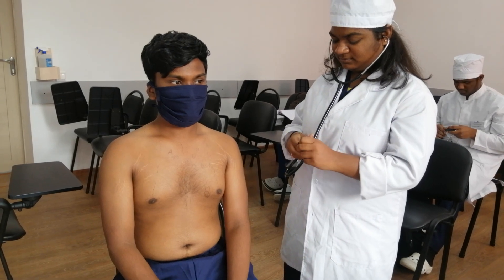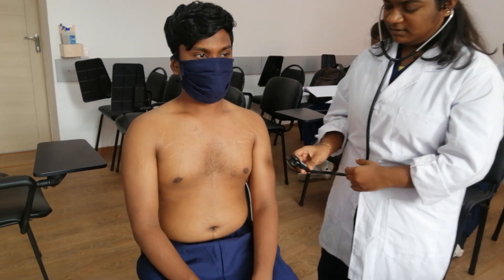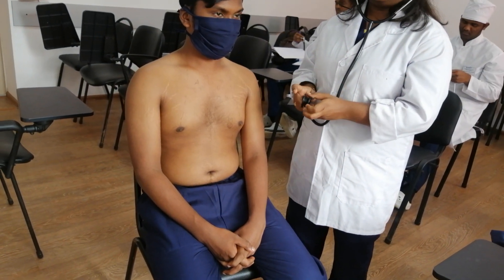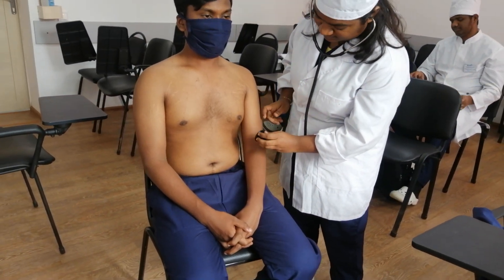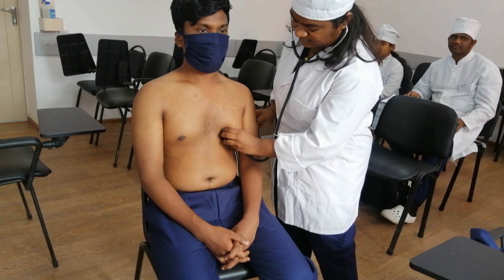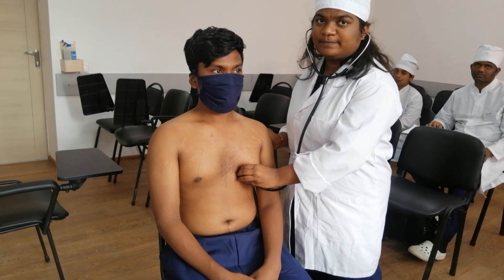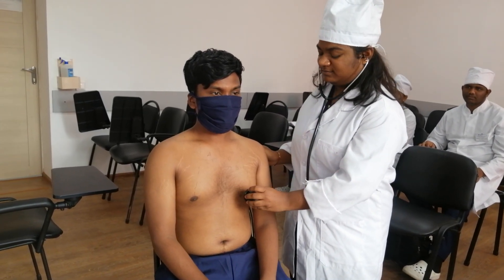Check the scope and confirm it is working. Place it at the mitral valve point and listen to the sound. Good. Next point.